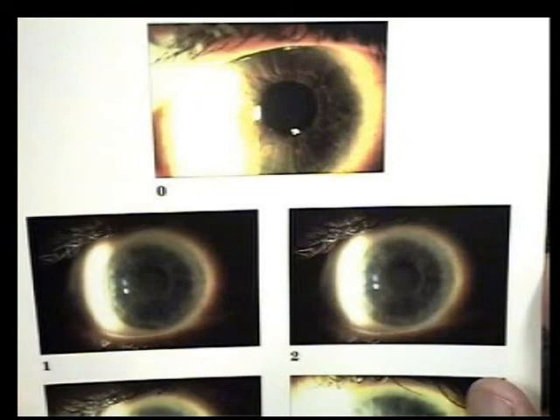One of the things we will look for during follow-up visits are signs of corneal swelling or edema. Now, here are some classic pictures. This was probably caused by a gas perm patient or an even older material patient, a contact lens wearer. Look at the upper slide.